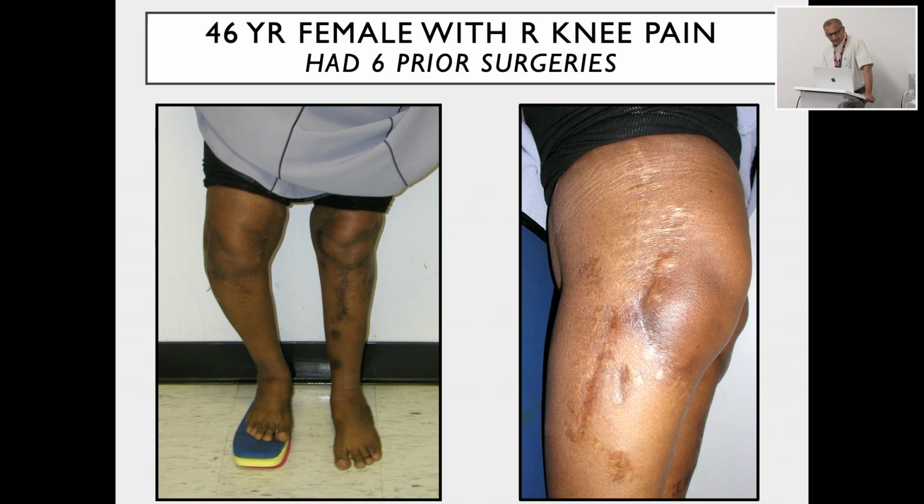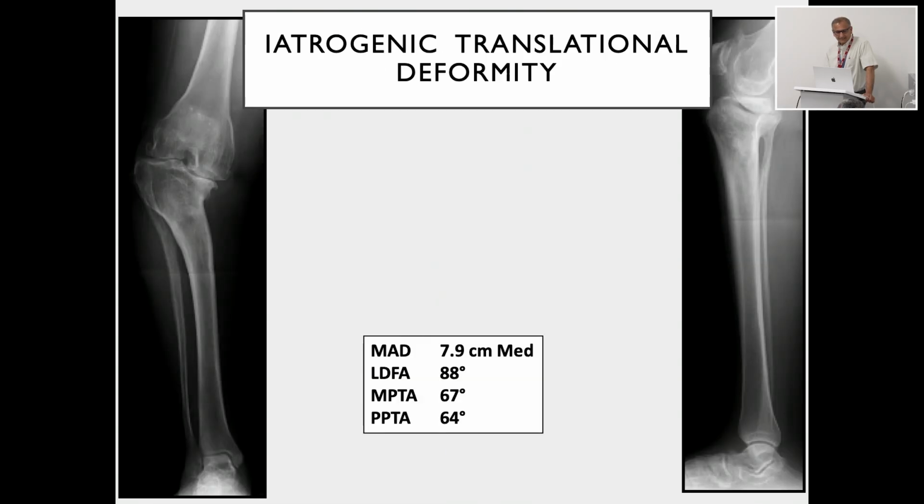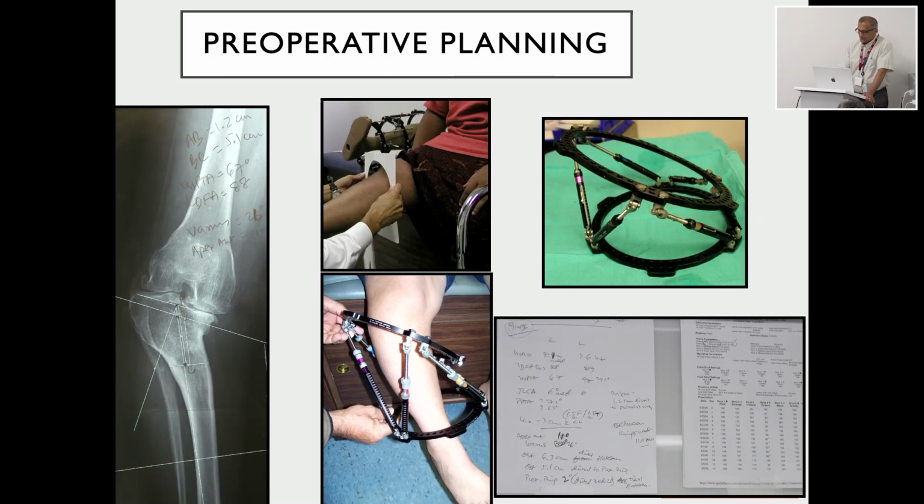This patient had like 6 prior surgeries and had medial compartment arthritis, primarily from Blount's as a child. And this was the error from prior surgeries, where they're trying to correct the angulation without fixing the translation, right? So you couldn't even put a total knee stem in the proximal tibia, because see how far that tibia is translated medially. So just to fix that, and of course, these were the days when they would pre-build the frames, which we actually don't do anymore.